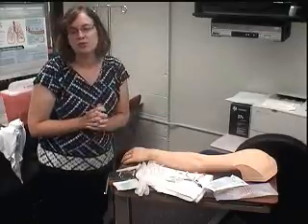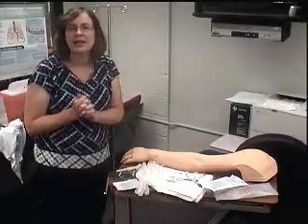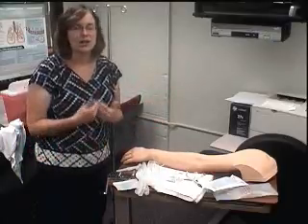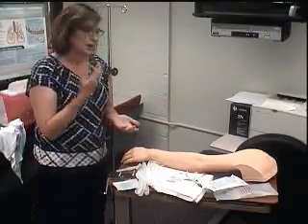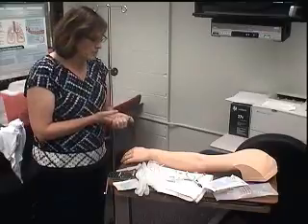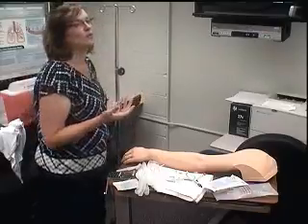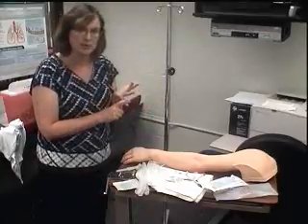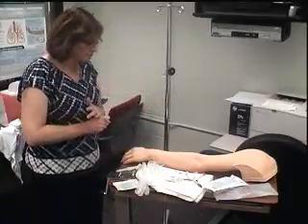First thing I want you to do is review the order. You need an order to put in fluids. And fluids is just like any other medication, so you do need an order. So you would need to be checking that order. All right, so let's say they have an order for normal saline at 75 an hour. You need to make sure you get the right type of fluids at the right rate.